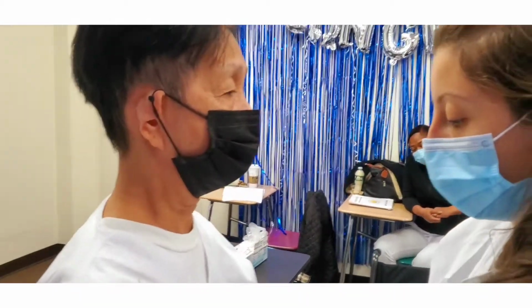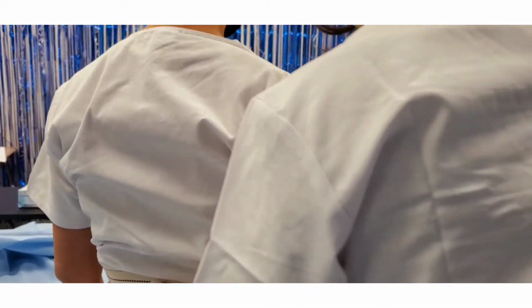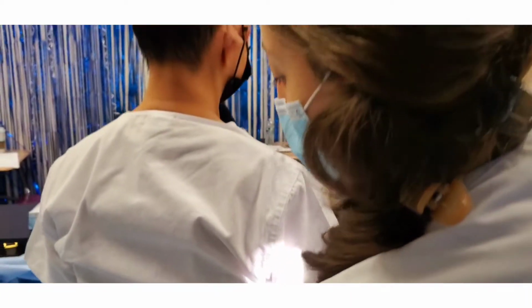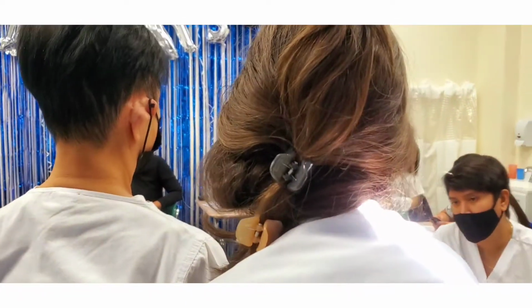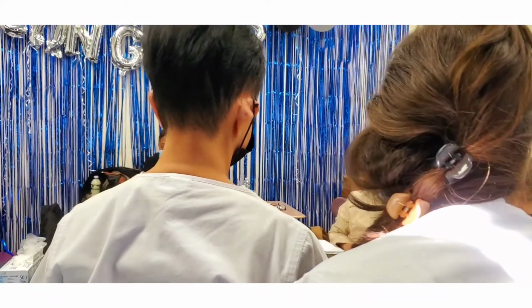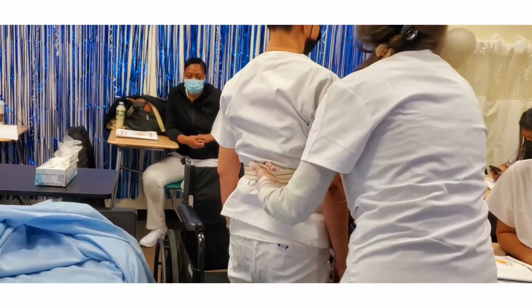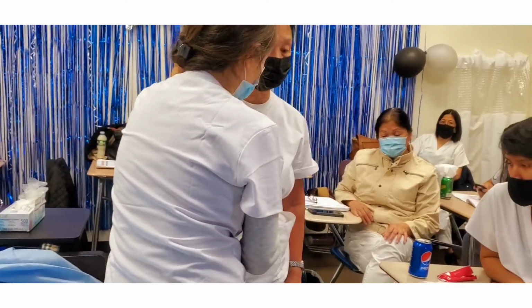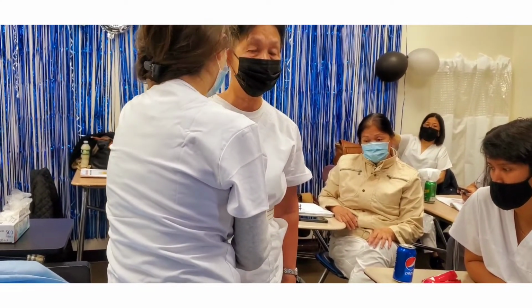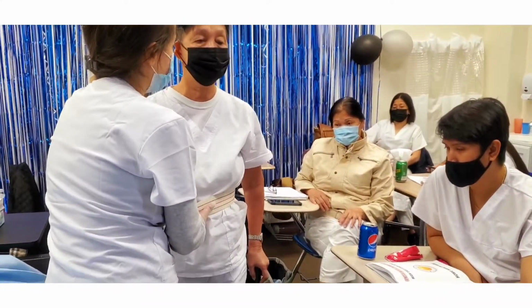Okay, great. So now I'm going to turn, and I'm going to walk right beside Miss Carpio, a little bit behind, not in front of her, holding one hand in the back, upwards, and one hand in the front, upwards. Okay. You ready? Yeah. Okay, let's walk. One, two, three. Going to turn slowly. How do you feel? I'm okay. Instruct her to hold on to the wheelchair's handles. And on the count of three, I'm going to sit you down.